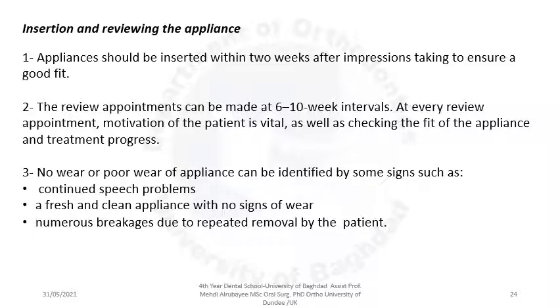Insertion and reviewing of the appliance. The appliance should be inserted within 2 weeks after impression taking to ensure a good fit and that the impression is not distorted. Secondly, the review appointment can be made at every 6 to 10 week interval. At every review appointment, motivation of the patient is vital, as well as checking the fit of the appliance and treatment progress.